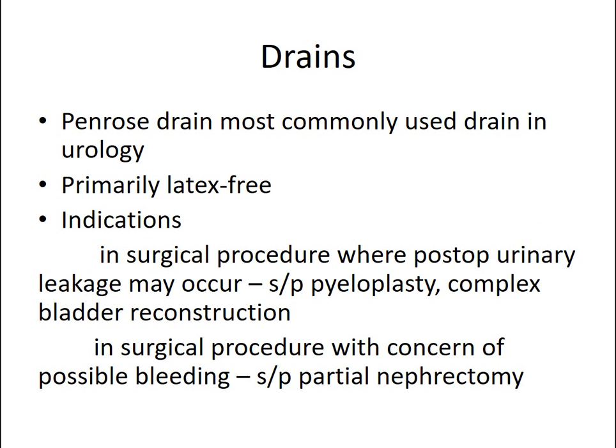Okay, so we're going to move away from catheters, suprapubic tubes, and Foley catheters and talk about drains. The most common drains that we use are Penrose drains in urology. They are primarily latex-free, and again, we use these in conditions or surgeries where we think there is a risk of urinary leakage or bleeding that we want to be able to monitor.